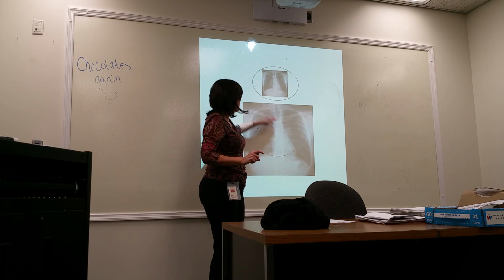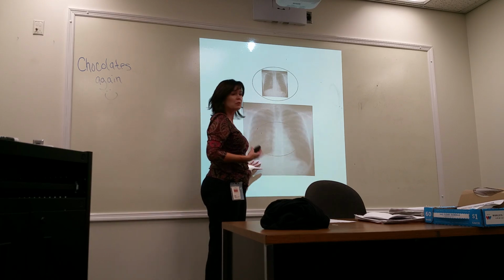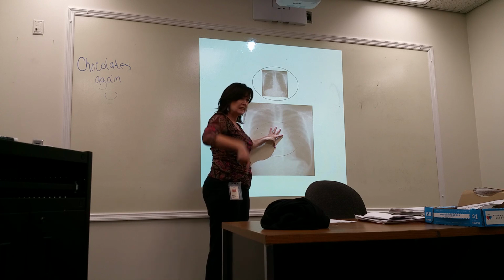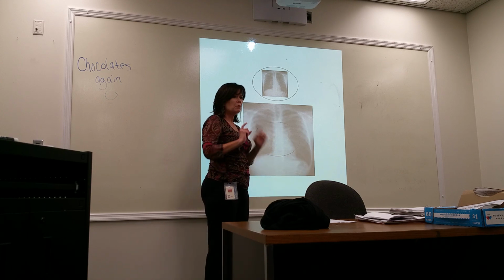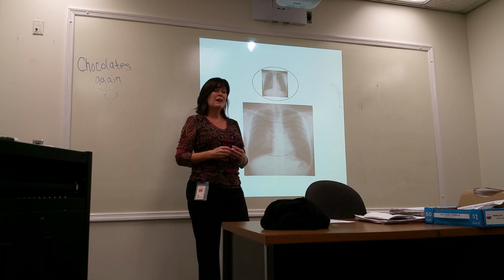So therefore, if you're losing all of these electrons, what happens to the image brightness? Goes down. It will decrease. It will be darker. There will be less detail, less bright. So do we like less bright? No. We want to be able to see the image. It is darker, so therefore, what has to happen?